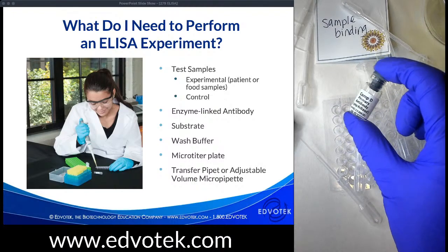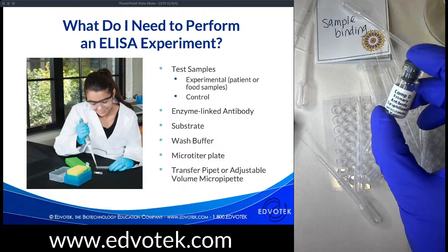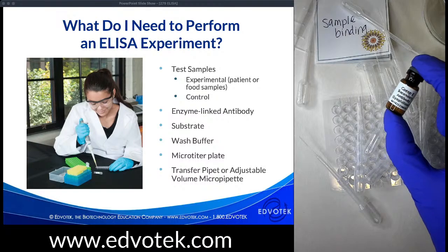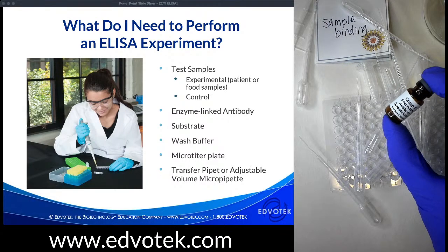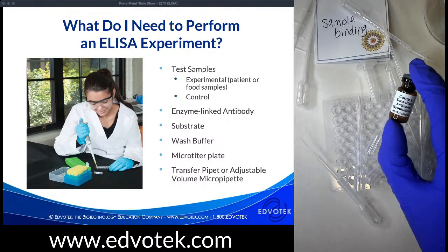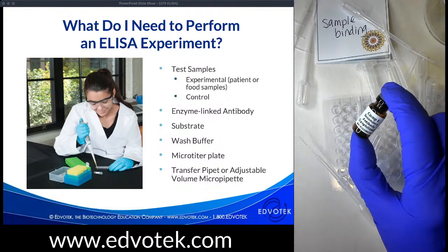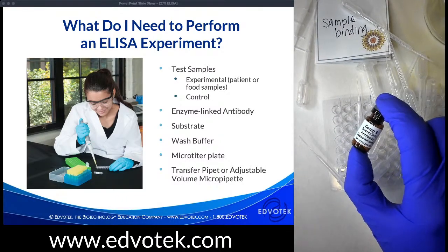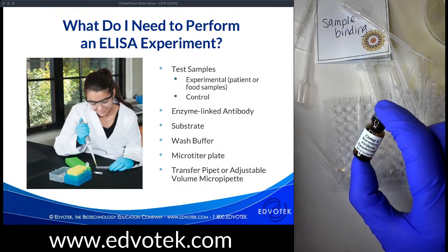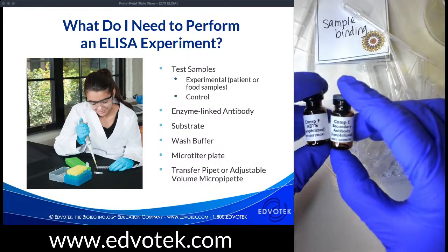So like I said, if we have whey as our antigen, we're going to have an anti-whey antibody as our primary antibody. Our secondary antibody is our enzyme-linked antibody. This antibody allows us to detect the presence of our protein complex in our samples. The thing about this antibody is it's just a regular antibody. And it's an anti-antibody, meaning it is an antibody that recognizes antibodies, but it is conjugated to an enzyme. And this is important because that enzyme is going to allow us to turn over a substrate, in this case ABTS, and that is going to allow us to visualize our results.